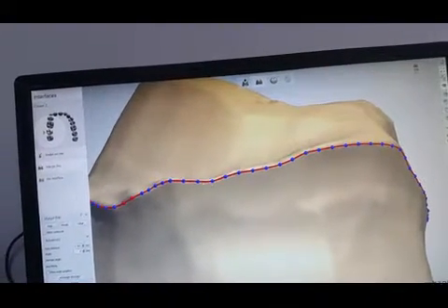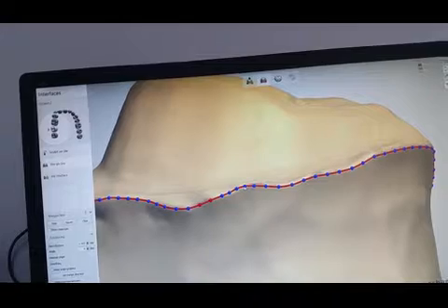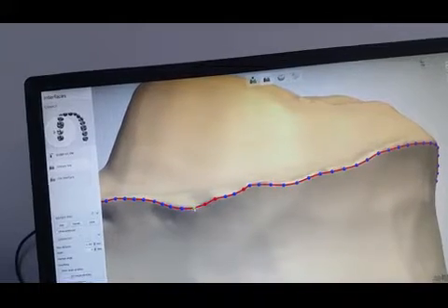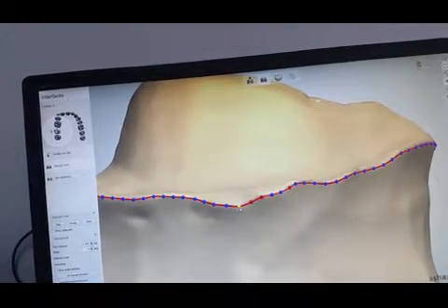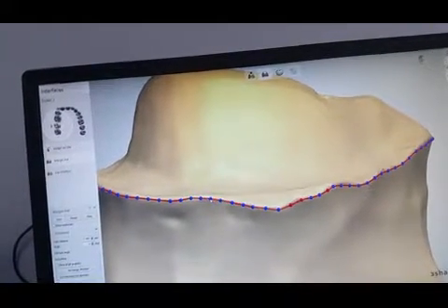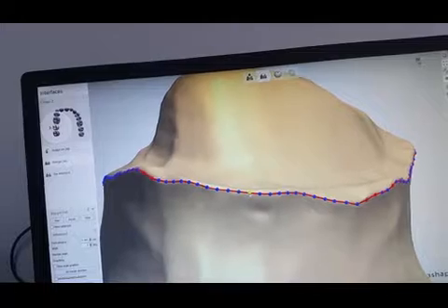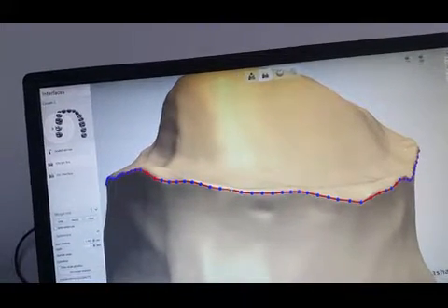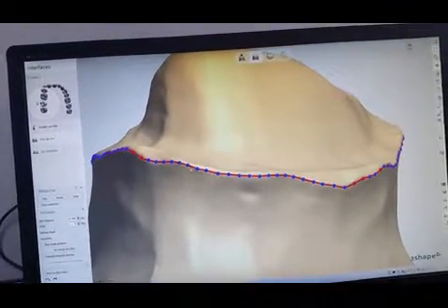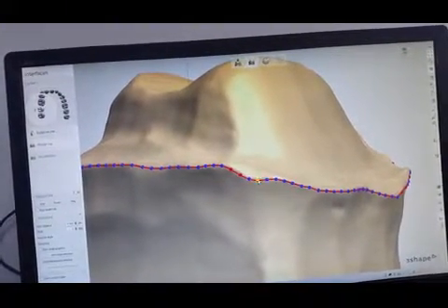And I usually, for the most amount of work, go into this mode right here and just drop the margin just a little bit, because a lot of times by the time you mill, if there is a little chip or something from the milling machine, that can be fixed, versus if it was short. It's still fixable. You can always add a little porcelain, but that kind of defeats the purpose of this CAD CAM altogether. We try to be as precise and as accurate as possible.